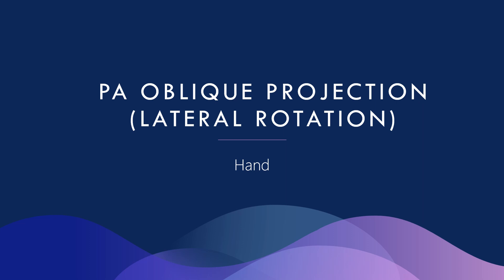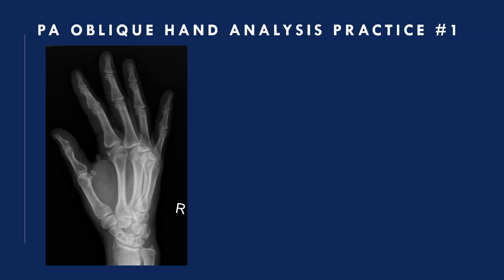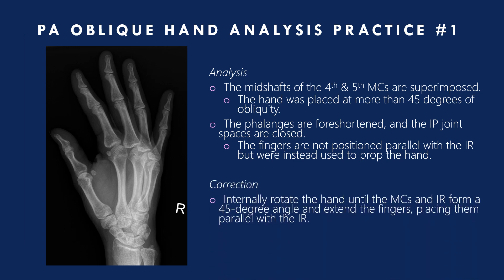PA oblique projection — lateral rotation of the hand: here are examples of proper positioning and the proper projection. Analysis practice one: the mid-shafts of the fourth and fifth metacarpals are superimposed — the hand was placed at more than 45 degrees of obliquity. The phalanges are foreshortened, IP joint spaces are closed, and the fingers were used to prop up the hand instead of being parallel with the IR. Correction: internally rotate the hand until the metacarpals and IR form a 45-degree angle, then extend the fingers parallel with the IR.